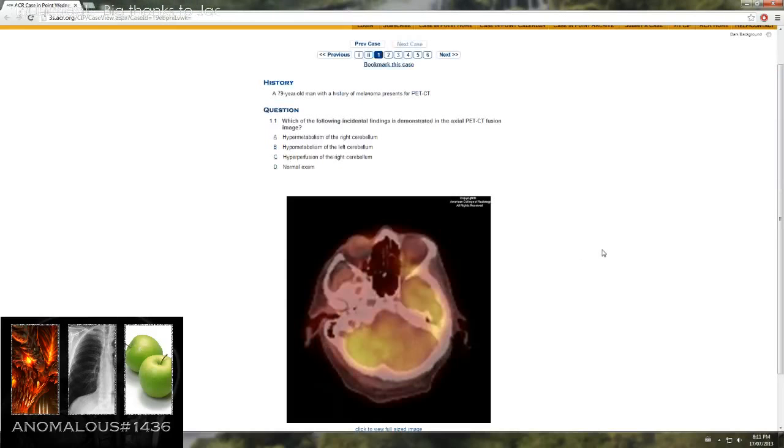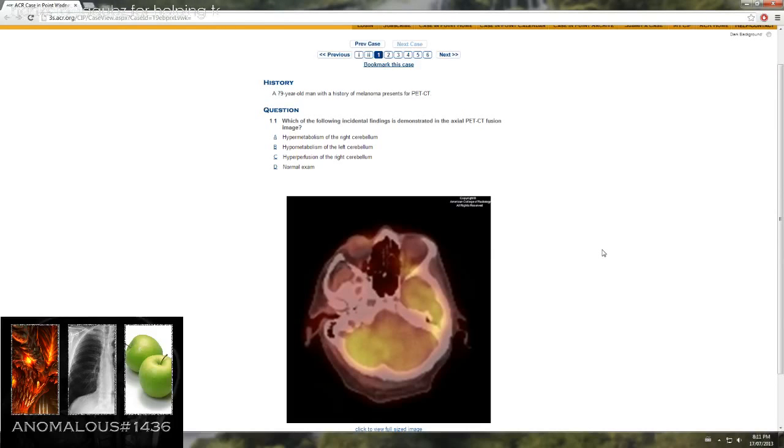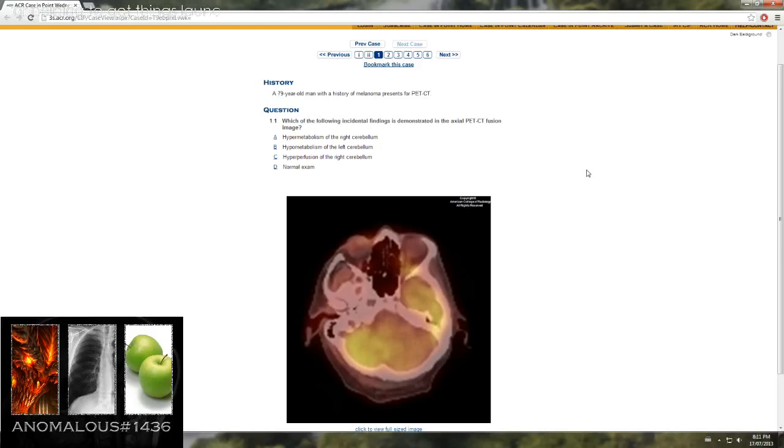Here we have a 79-year-old man with a history of melanoma who presents for a PET CT, which of the following incidental findings is demonstrated in the axial PET CT fusion image.